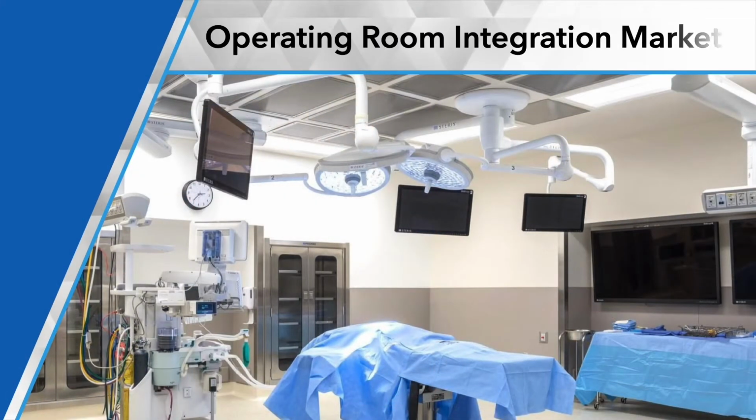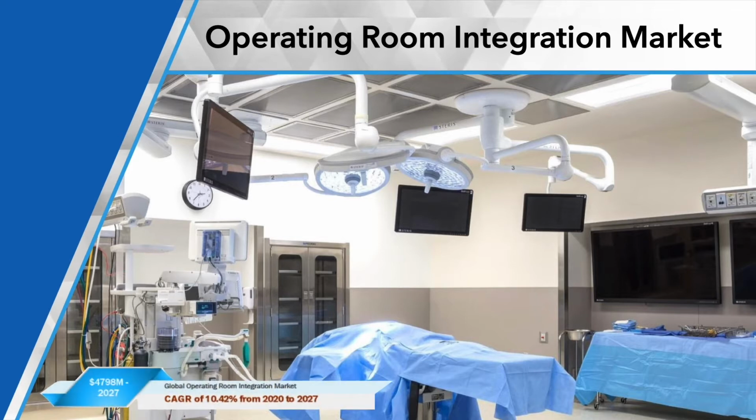So, for those of you who are not familiar with operating room integration, it's sort of what's shown in the picture here, and the implementation that Jam Labs does is far beyond just the OR, but also outside the OR. So think of audio video routing as an orchestra that happens in the OR, where there's a person called a circulating nurse, and one of her jobs is to route different types of sources to different types of destination points. And right now I'm showing you typically a boom mounted operating room.